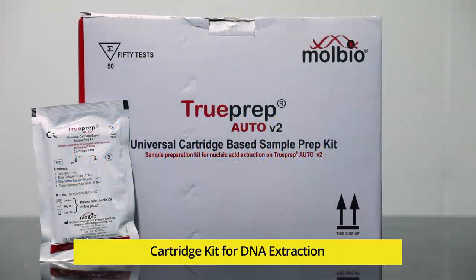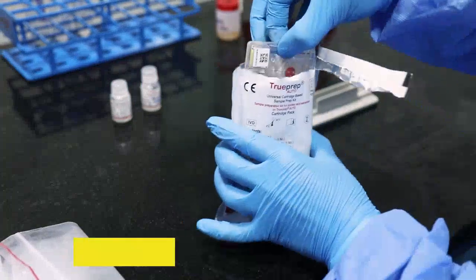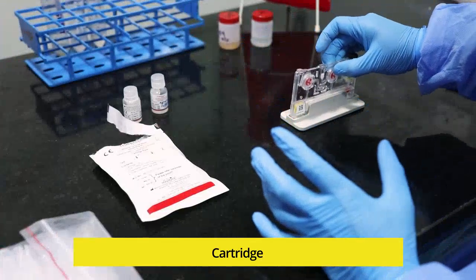After processing the sputum sample, let us see how to load it into the TrueNat cartridge for DNA extraction. Take out the cartridge pouch from the TruePrep Auto V2 universal cartridge-based sample prep kit. Open the cartridge pouch gently, take out the cartridge and place it on the cartridge stand.